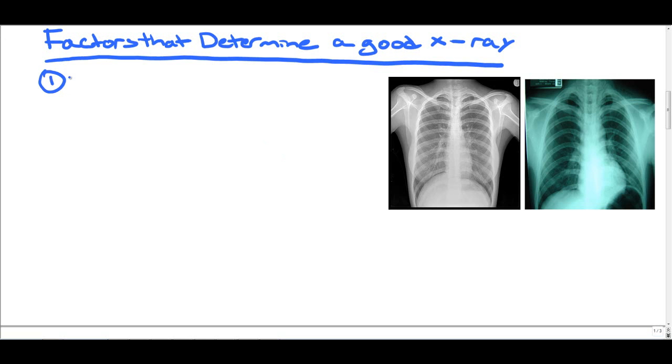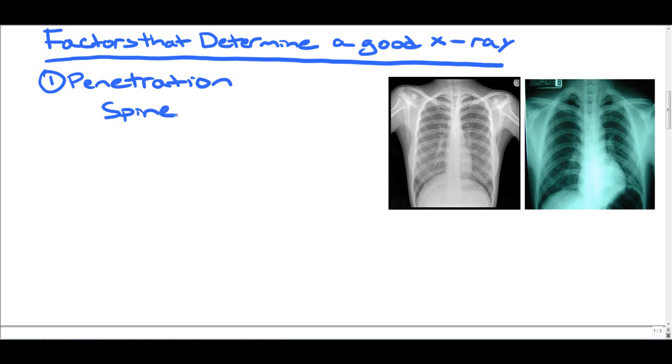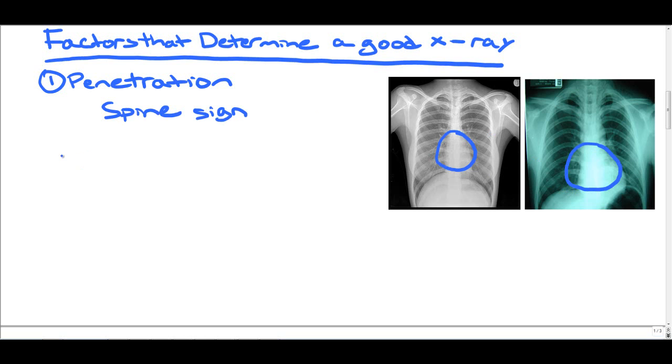One is penetration. Penetration is how overexposed or underexposed an x-ray is. It's very important because if an x-ray is underexposed or overexposed, it can lead you to errors in your diagnosis. The way to determine penetration is to look at the spine sign. Can you see the spine through the cardiac silhouette? In the first x-ray you can. In the second x-ray, it's very difficult to see, and I actually think that second x-ray is a little underpenetrated.